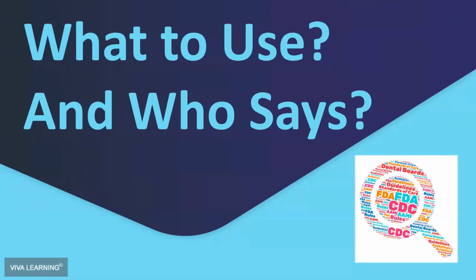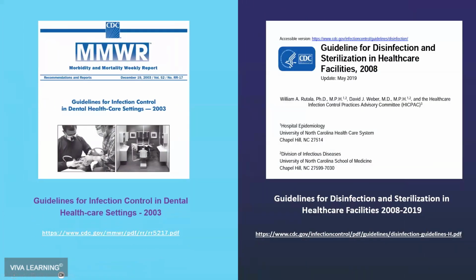So the what question that I have for you is, what do you use and who says we have to do it? In other words, who is setting our standard of care? The CDC is the primary driver of the standard of care for infection prevention and control in dentistry.